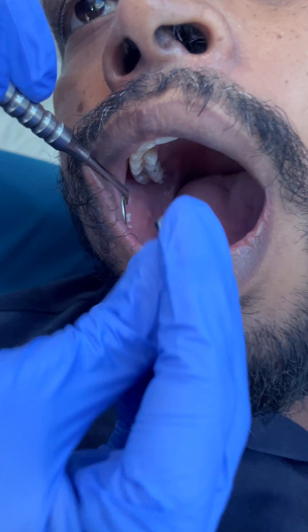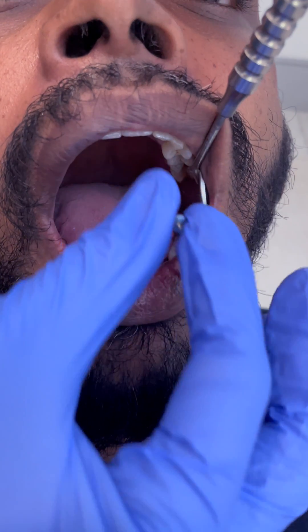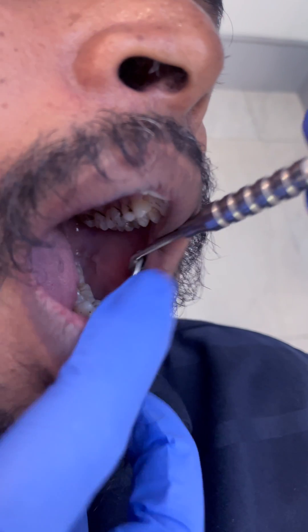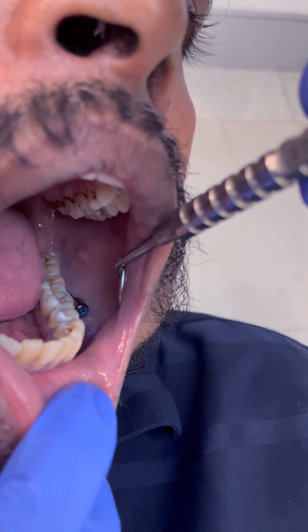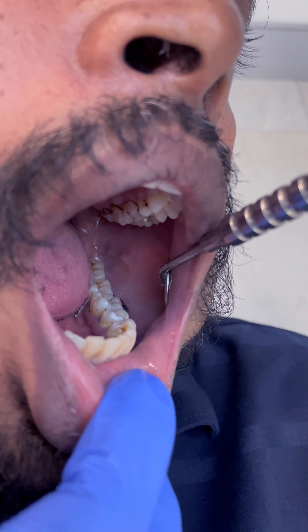If this happens on the other side — let's say you're working on that side, you disconnect it, take it out, and you drop it — immediately turn them to the other side so that it sits safely in the buccal mucosa of that side, again making it impossible for them to swallow.